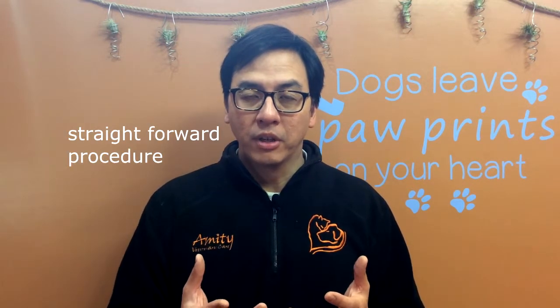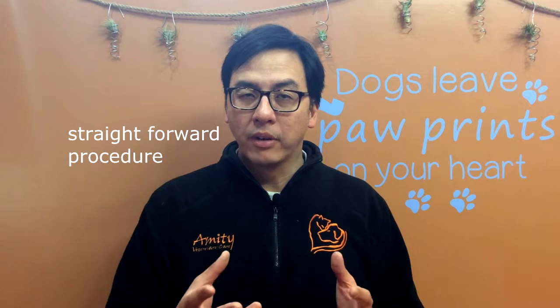So these are the reasons why we feel that lap spays are a little bit nicer or better than traditional open spays, because for the surgeon it is a much more straightforward procedure, because like I said, everything is magnified, there is better illumination, there is no trickiness, technical difficulty in trying to break a ligament, hoping not to spill any blood or break any tissues or things like that.